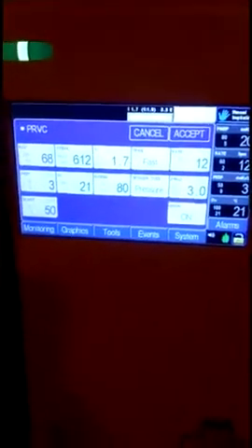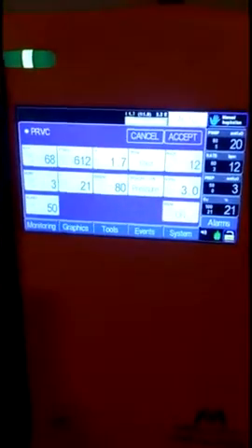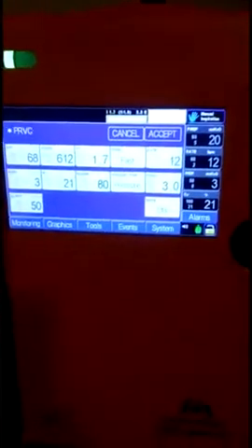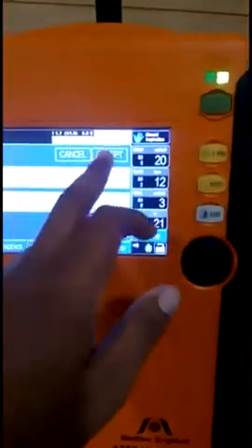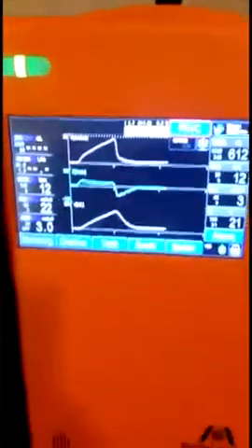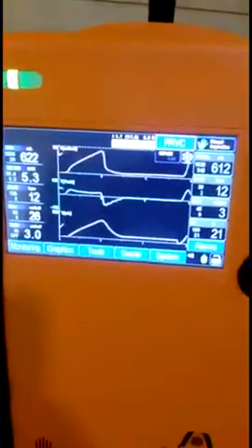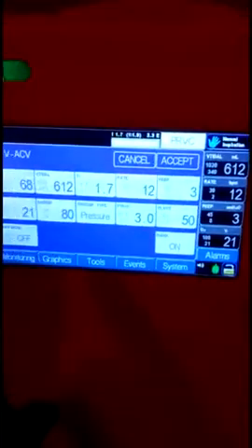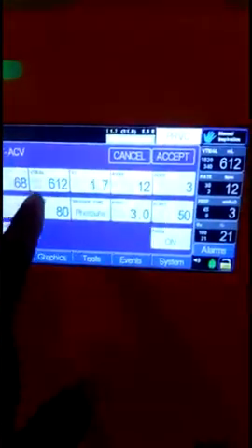If you want to change the modes, we are offering all ventilator modes including PRVC, Volume Assist Control Ventilation, Pressure Assist Control Ventilation, PRVC SIMV, Volume Synchronized Intermittent Mandatory Ventilation, and PSIMV. One key advantage is that in all modes you get both invasive as well as non-invasive options.